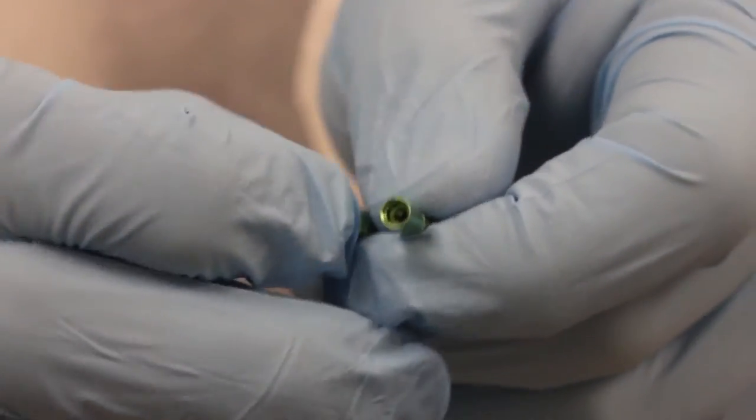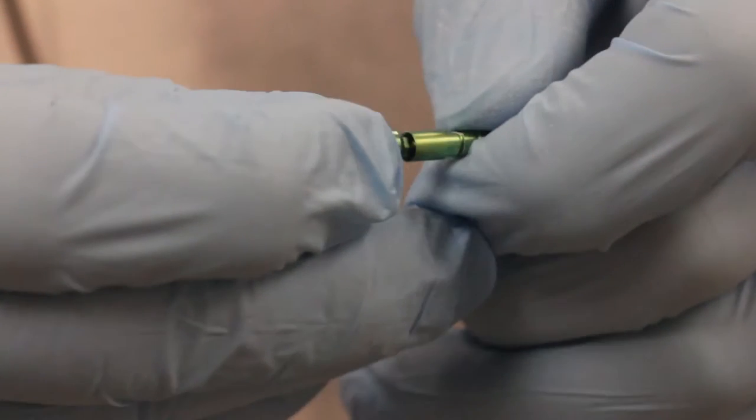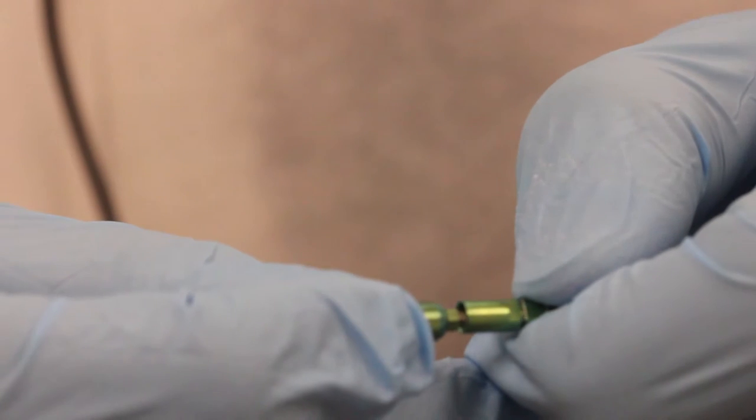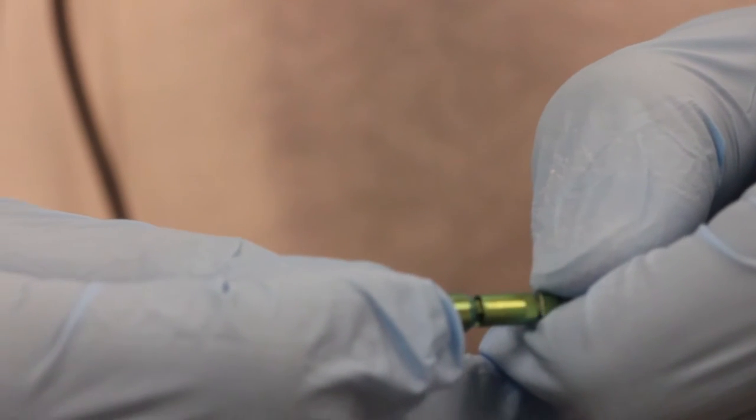On the left, we have the impression coping, and on the right is the implant analog. We call it an analog because it's analogous to the implant, or it mimics the implant. The impression coping has a hex, and it inserts into the analog.